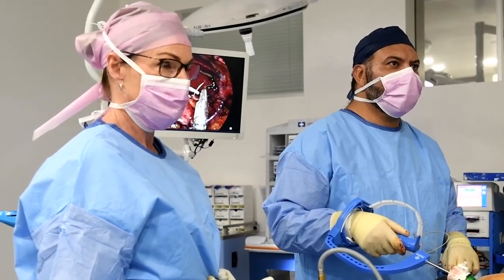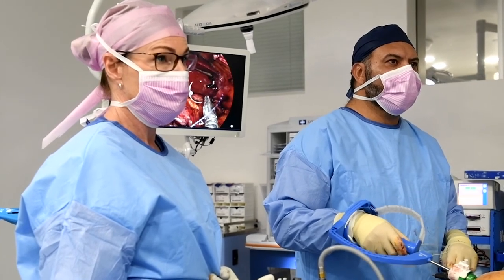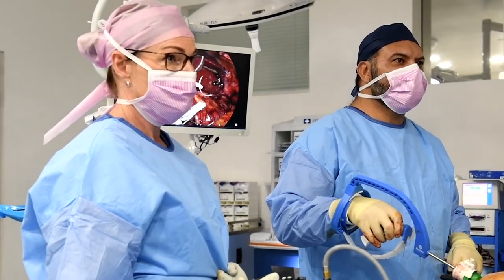The first procedures with FlexDex in Australia were done by our team at Hurstville Private Hospital in Sydney. Hurstville Private Hospital is a very progressive hospital. They have two surgical robotic systems already operating and despite that, they were very keen and enthusiastic about starting to use the FlexDex device, recognising that even with two robotic systems in use, there are still more cases than there are robots.